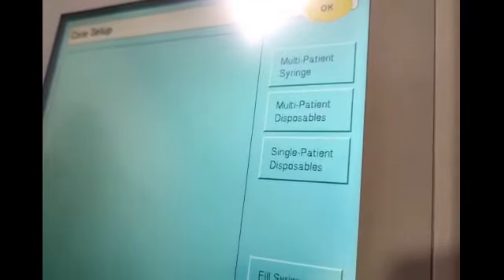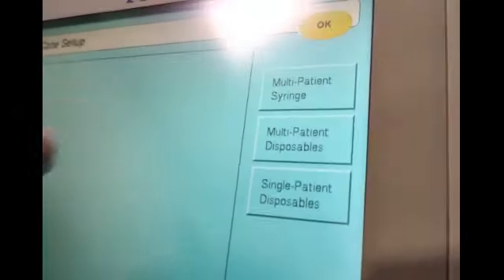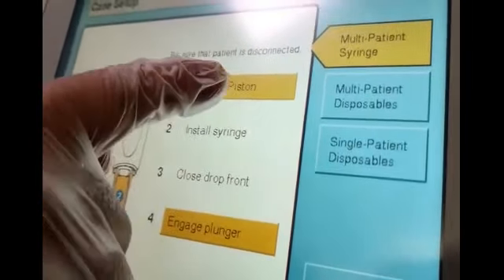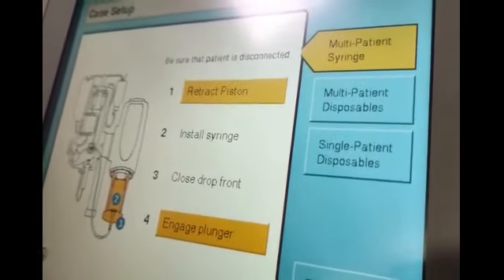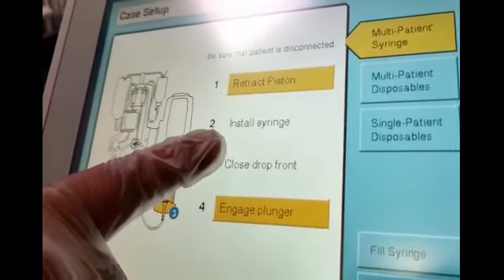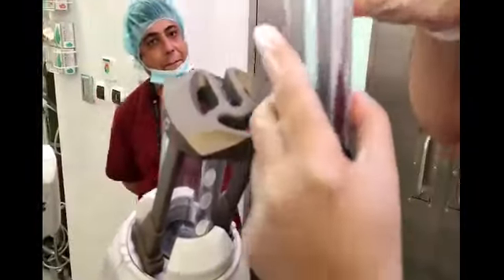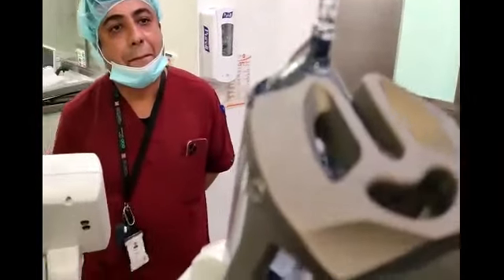Once you continue, the first thing you need to do is set up the machine. First of all, you need to install the tubing — it will tell you how to install it. There are multiple guidelines here, so we follow the instructions. The first step says 'Retract the piston.' Once you press it, the piston will go all the way down and be retracted. The second step is to install the syringe.